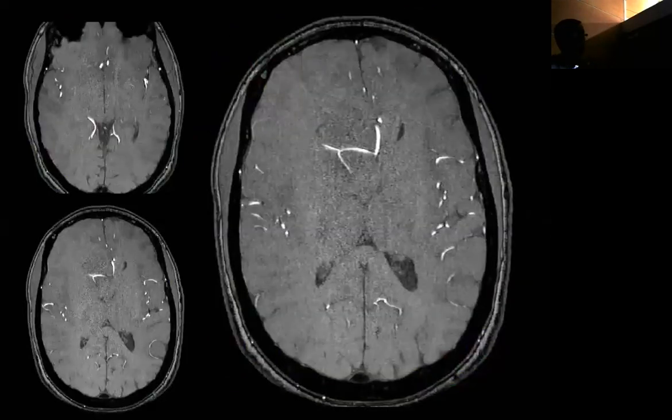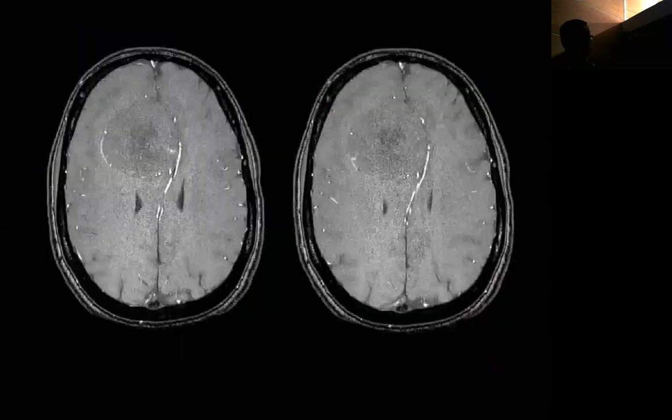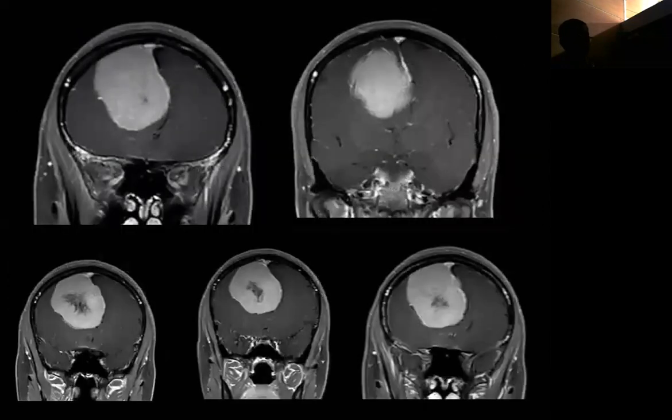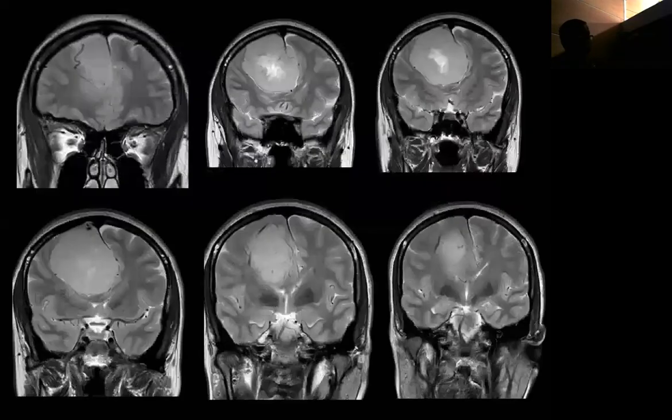Again, look at the vessels. It is inside the tumor. This is on the left side, this is the right side. It is inside the tumor, and this is another challenge. Here, just emerging from the tumor. The same thing in the coronal. Here you can see the vessels. So this is another challenge: the vessels are inside the tumor.